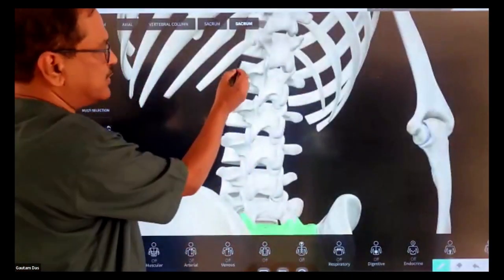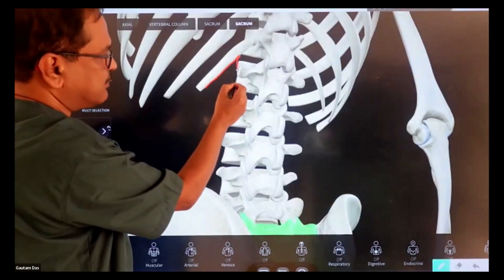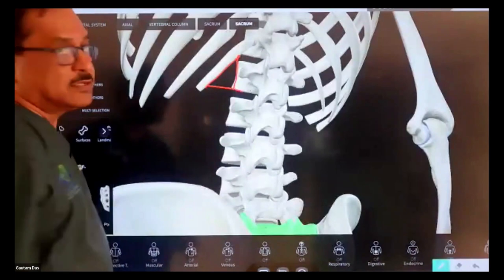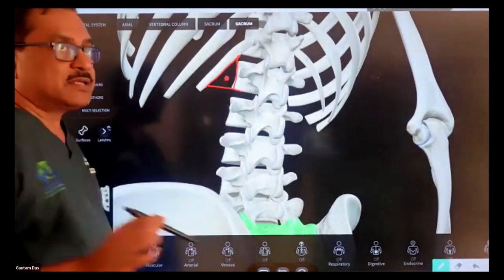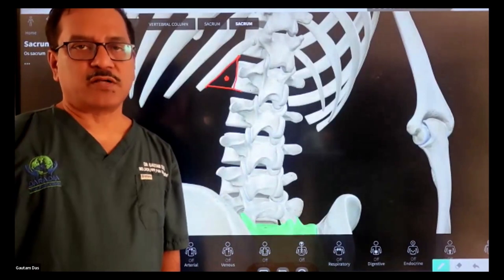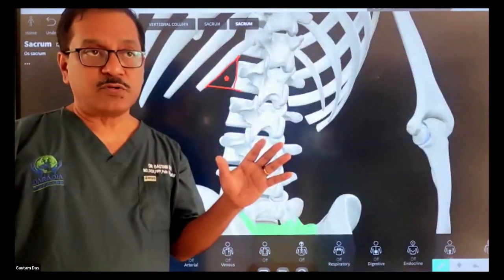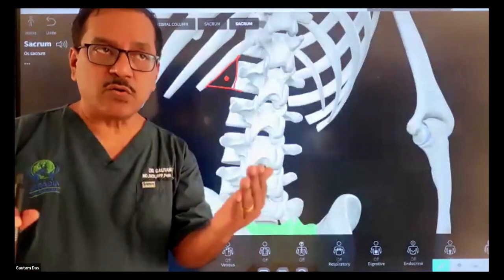the triangle was bounded one side by the 12th rib, another side by the vertebral body, and base is open. You imagine a line there. So if you go through the middle of this triangle with a tunnel vision, coaxial view, directly, then you are always going to hit the aorta. So this was our hypothesis based on studying different CT scan reports. And then you go through the aorta.